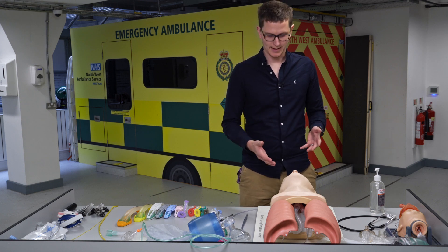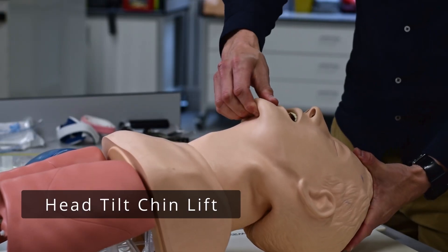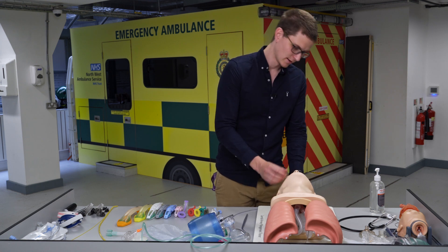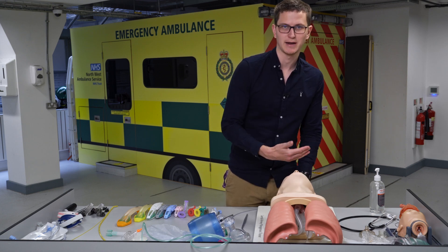First we're going to start off with head tilt, chin lift, and jaw thrust. Head tilt chin lift — as it sounds, we're going to tilt the head and lift the jaw. The purpose of this is to lift the tongue off the back of the airway so that the airway is clear. It also allows us to see what's going on and assess if the airway is patent or not.